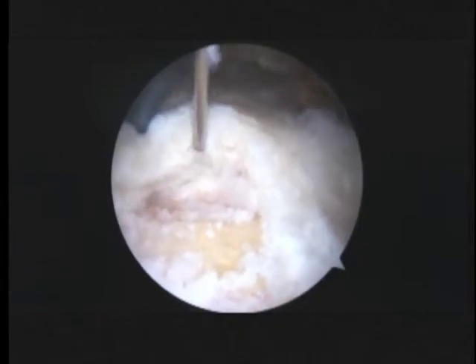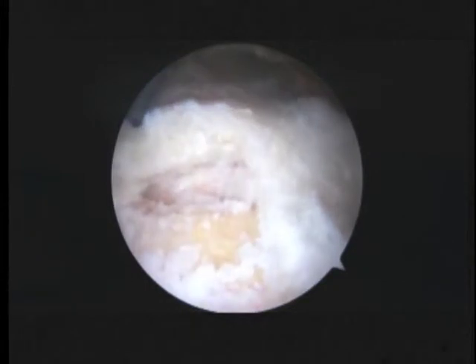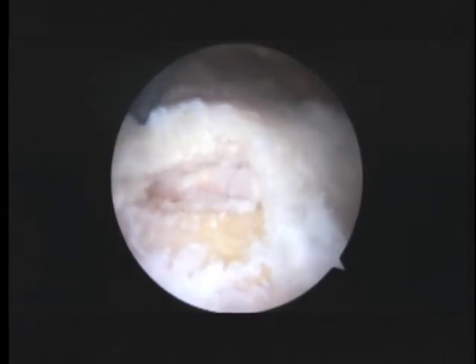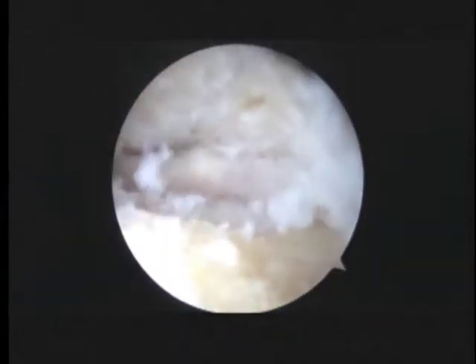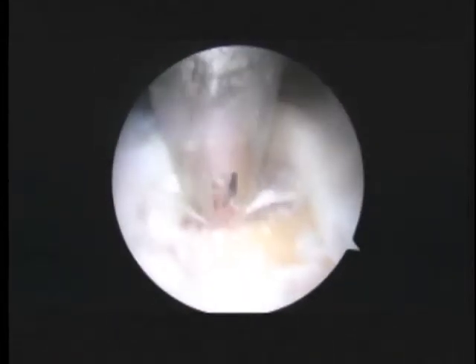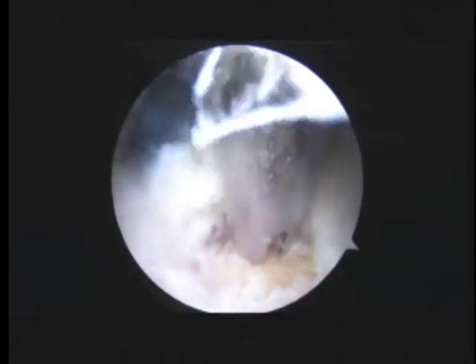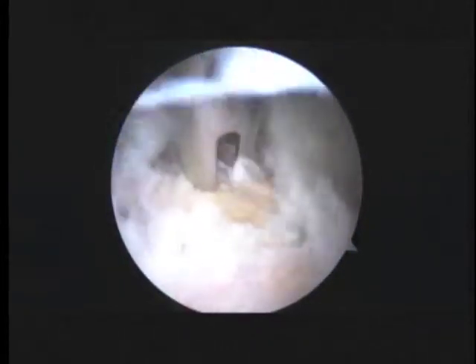Okay, so here's our spinal needle so we can check our angle of insertion. We're going to go ahead and place the anchor down right about here. After making a little nick in the skin, we'll place our guide down. There's our guide. Again, we're just checking our angle. Okay, so here's our guide. We're going to go ahead and place our suture anchor down right there.